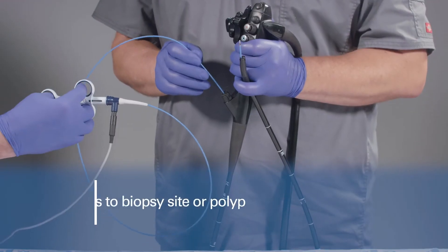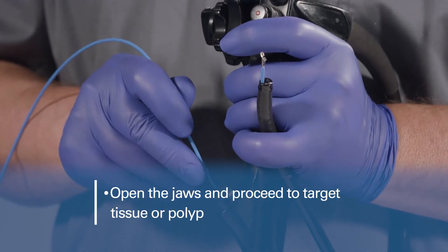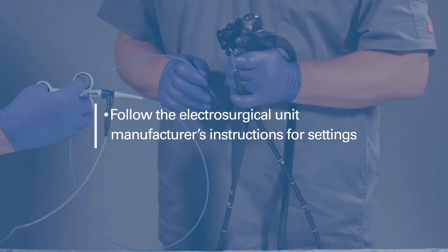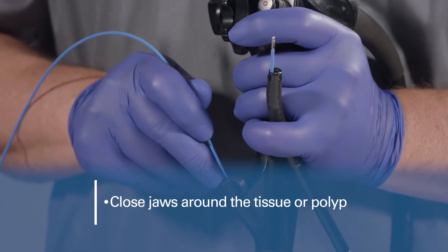Advance the forceps to the desired biopsy site or polyp. Open the jaws and proceed to advance onto the target tissue or polyp. Follow the electrosurgical unit manufacturer's instructions for settings and verify the settings. Using slight pressure on the handle, close the forceps around the tissue or polyp.